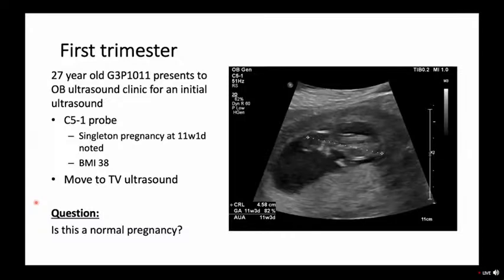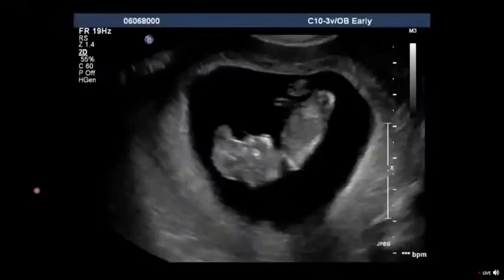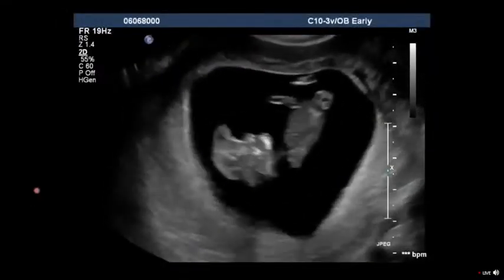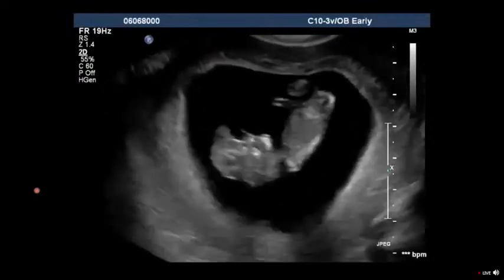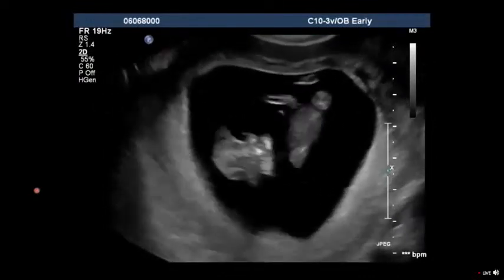The top of the skull. Yeah, again, maybe it's related to habitus, but something looks a little odd right here. I would liberally encourage you to move from transabdominal to transvaginal anytime you have a suspicion about things. What do you think now?